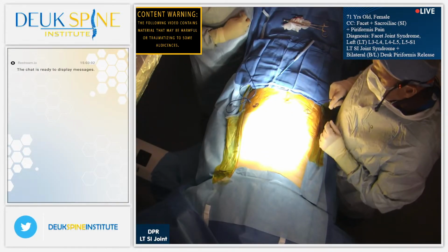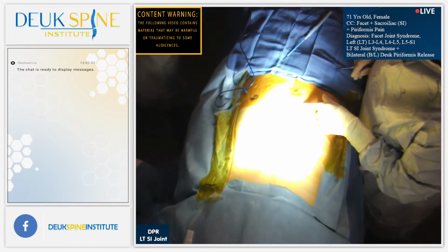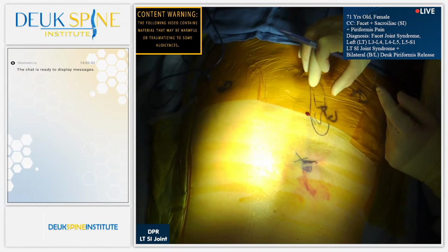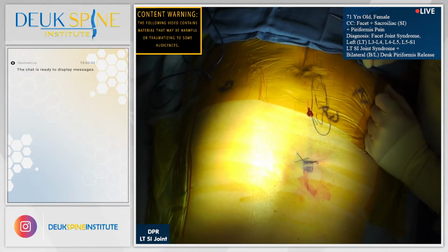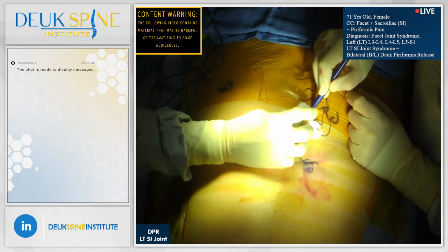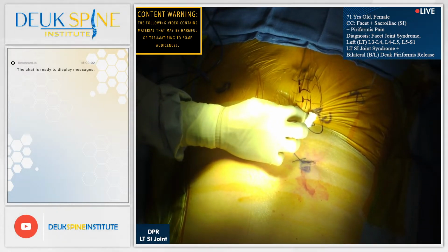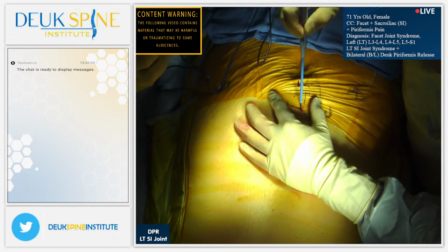This patient has just had her facets treated, but she also has left sacroiliac joint arthritis and pain. The SI joint is just above the tailbone. Hers on the left side is what's hurting her. We've just made a small incision. We're going to go in and basically sever 5 pain nerves to the joint. It's called a rhizotomy. I have to basically cut 5 of these pain nerves, and that takes the pain away. That is the best treatment in the world for this problem. We do it right here at Deuk Spine.